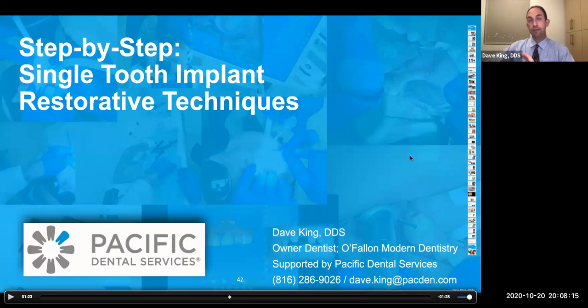Now, is zirconia stronger? Absolutely. Certain zirconias are much stronger than Emax, but we can't necessarily default to always using zirconia when there are other benefits elsewhere. I like to use this example for my assistants when they ask, why did you pick the Emax over the zirconia? It's usually the newer assistants who have worked somewhere else, where their doc always used zirconia everywhere. So I'll ask them, well, are you better off?